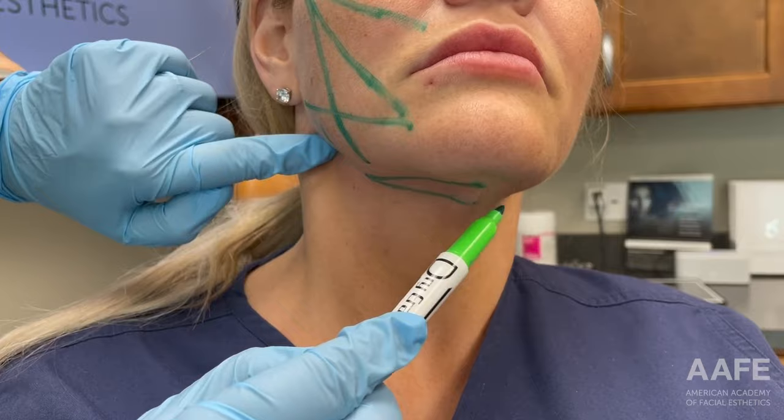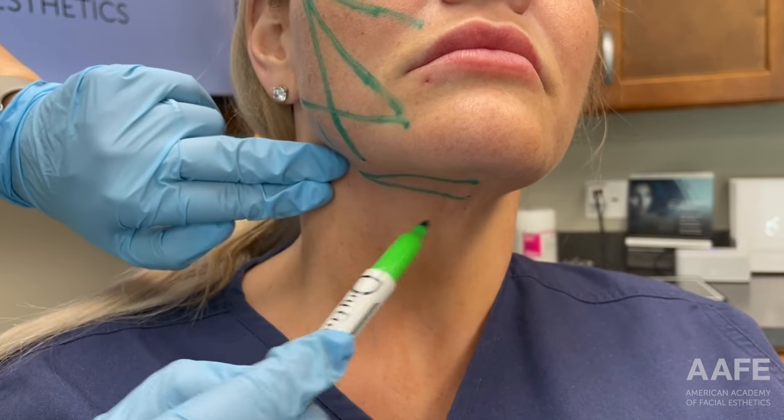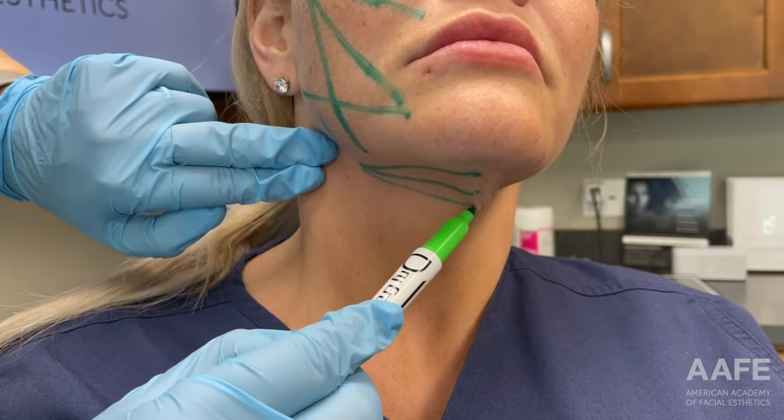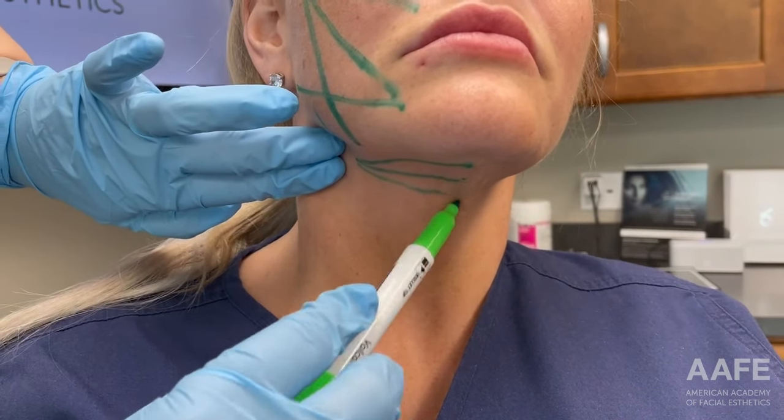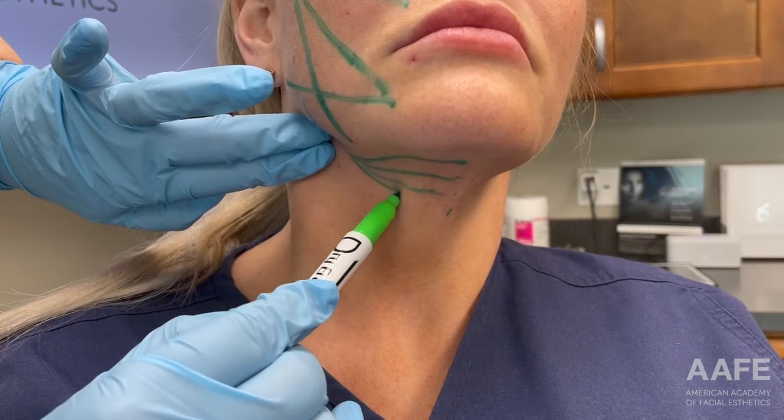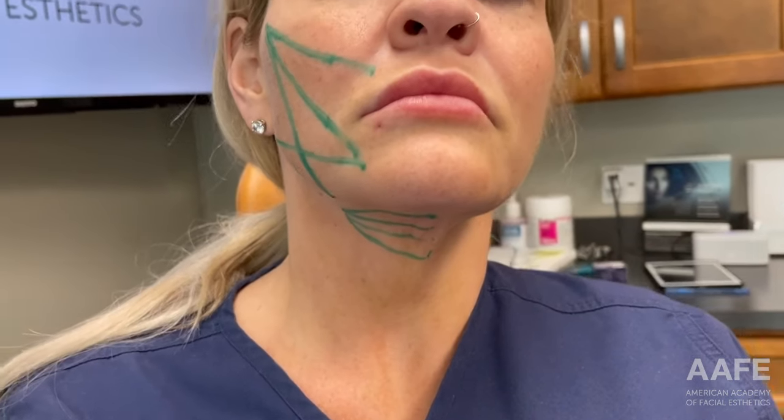You can see I'm just spacing these out almost like a little bit of a fan, so that way once all the threads are in, we can pull her back. That's how we've marked one side of the face. We'll do the other side similarly, but keeping in mind that the sides of our faces are sisters, not twins. She might have a slightly different treatment plan on the opposite side of her face, depending on her anatomy and the deficits that we see there.